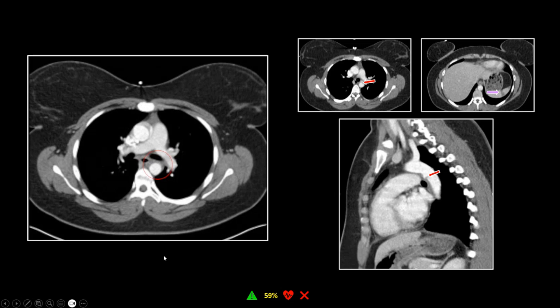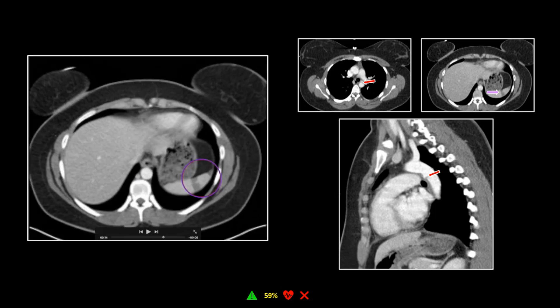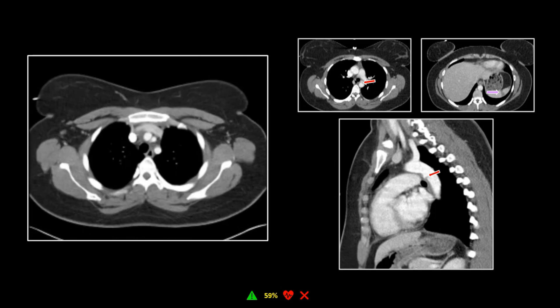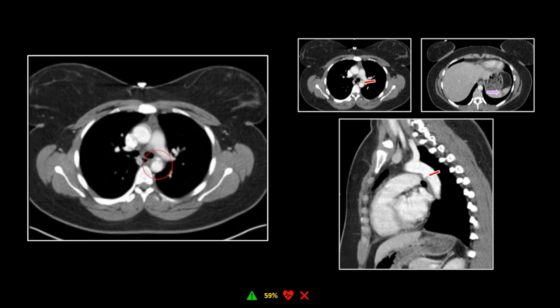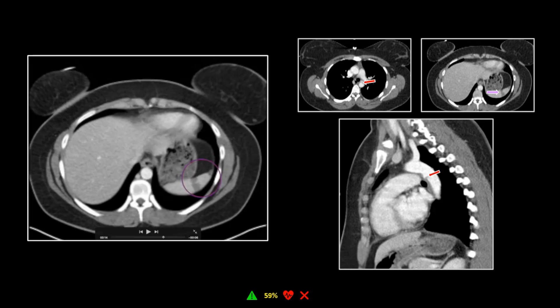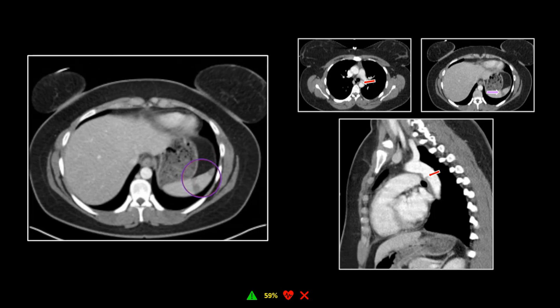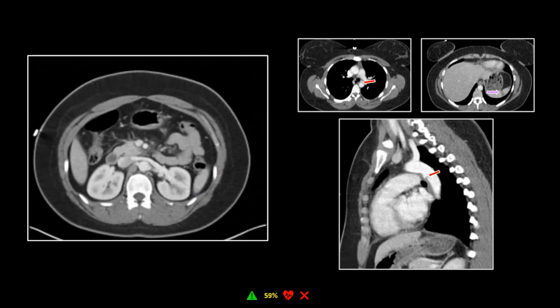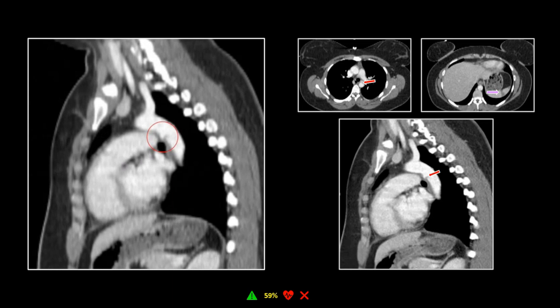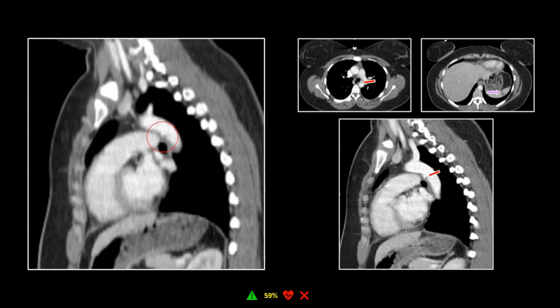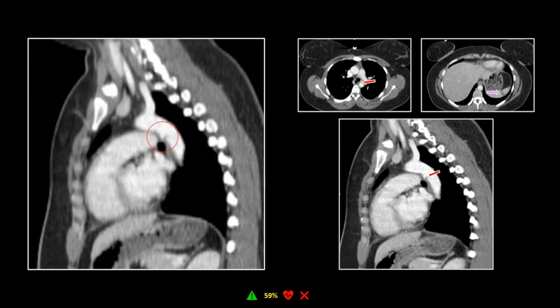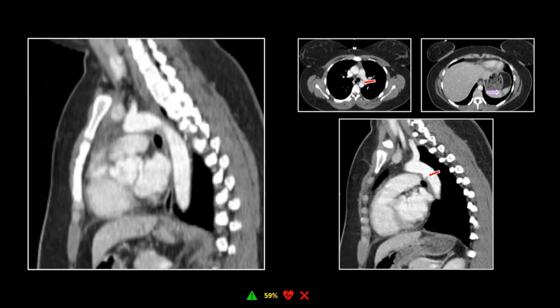Here is the irregular laceration. Going down into the abdomen, you can see there are actually a couple of those little hypodensities in the subcapsular spleen. Note that irregularity, minimal surrounding stranding, and evidence of microembolic injury to the spleen. And here it is on the sagittal — that vertically oriented, small finding with fairly acute angles to the native aorta and an intimal flap.